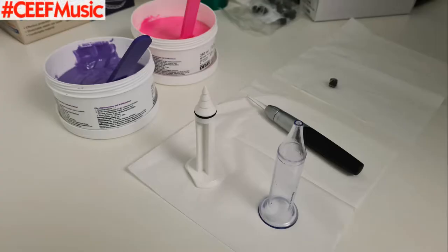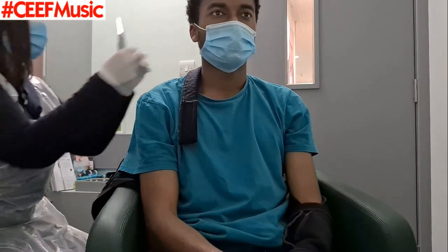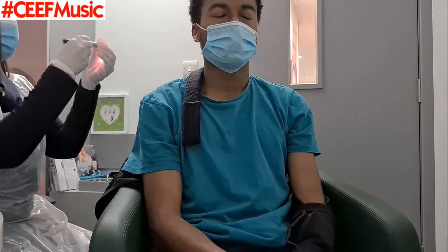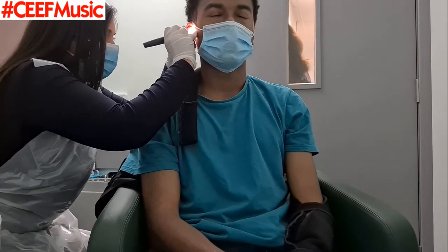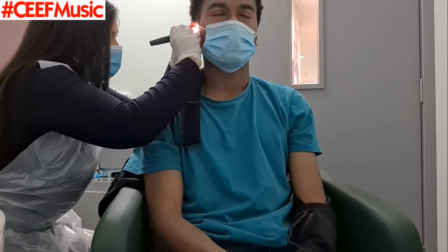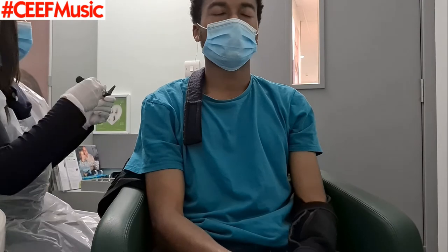As you can see, we've got the pastes and stuff, whatever the thing is called that they use. They use two of those and mix them together like Play-Doh. At the moment, what's happening is my ears are just getting a final check. But as I was saying, what happens is they mix these two substances together and that's what they actually inject.